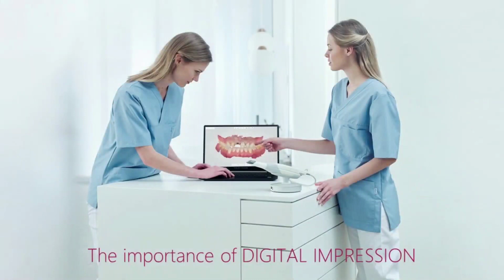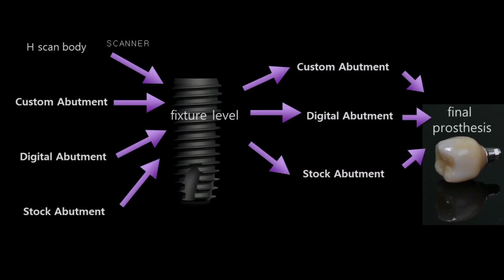And this is why the intraoral scan or digital impression becomes so important. The impression process is very important, as you see. As you see on the left, the scan body, CA, DA, and SA libraries are used exactly to pinpoint the location and position of the implant and get the fixture level impression. Let me explain each one through case examples.